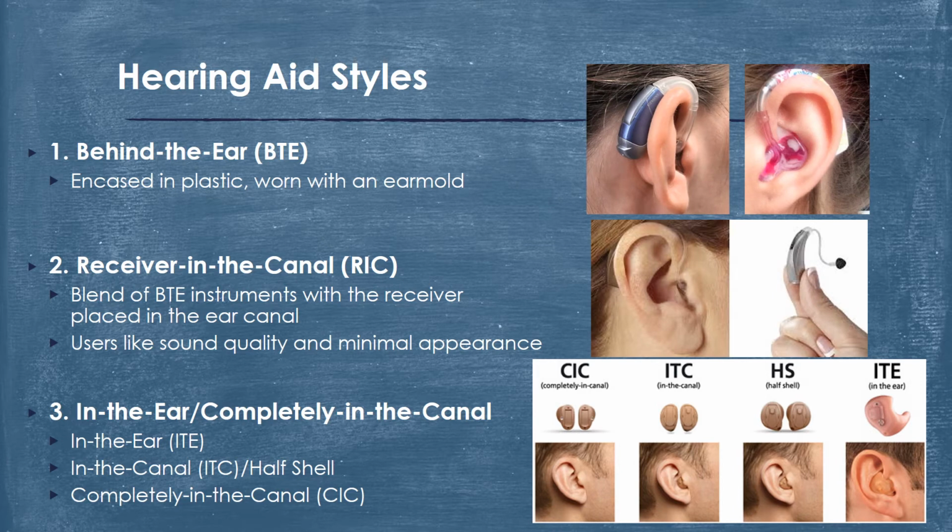So let's start out with the behind the ear hearing aid. So you can see those in the top pictures on the right.